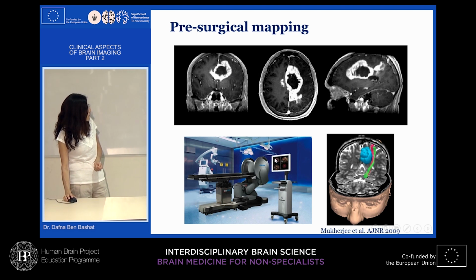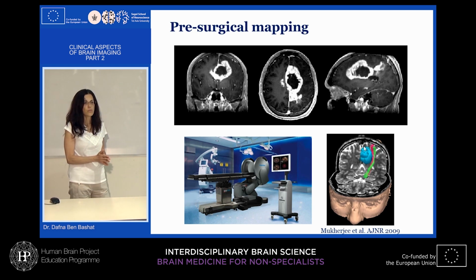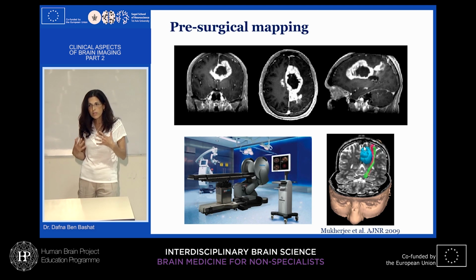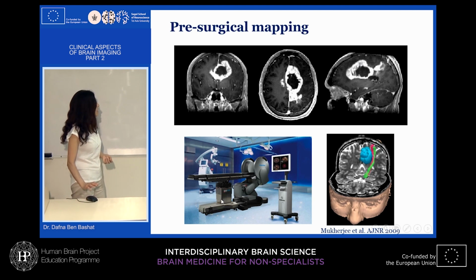So currently we provide to the neurosurgeon information regarding functional areas from fMRI and structural major fibers. For example, you can see here a tumor, and we can see here the corticospinal tract, because we don't want severe neurological deficits. We don't want him to come and not be able to walk or not be able to talk, or be blind. So this major function or major network, in this case, we map, and all this information goes down to the operating room.